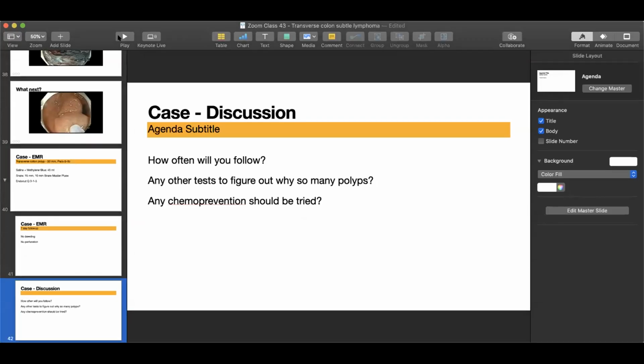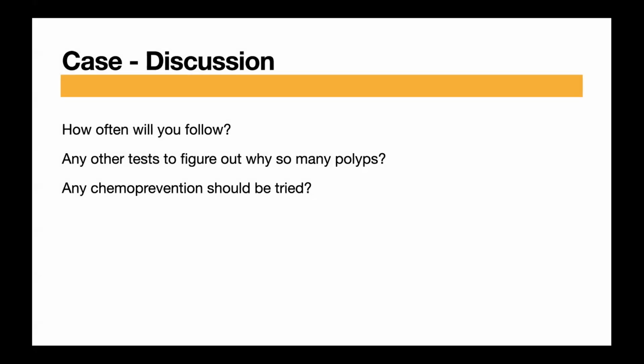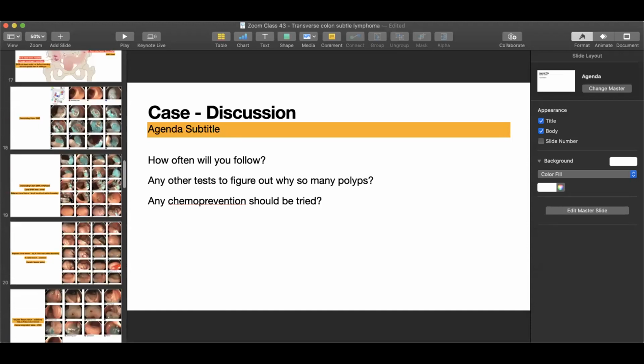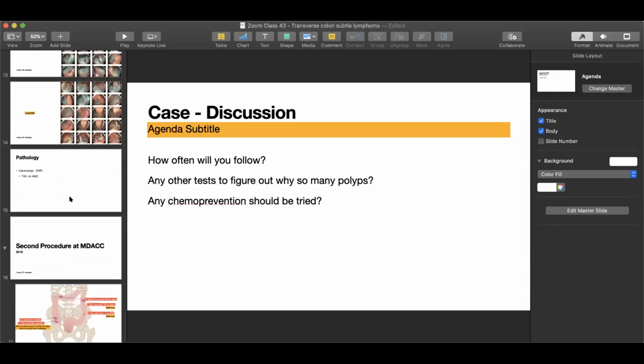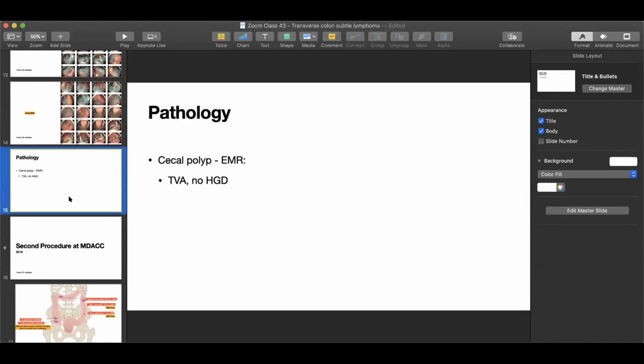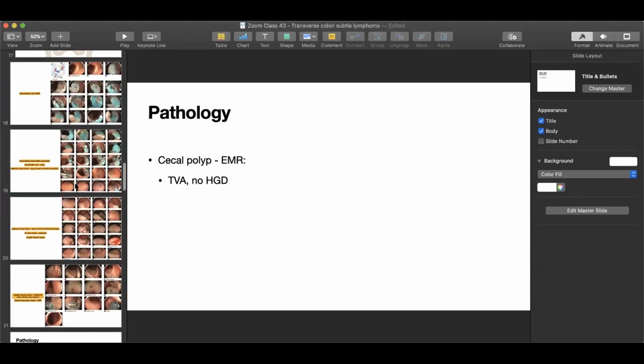I think based on the pathologic criteria that we had, there is no other diagnosis but to call it tubular adenoma, however unusual it looks. Mm-hmm. So you would suggest an adenomatous polyposis syndrome, am I right?